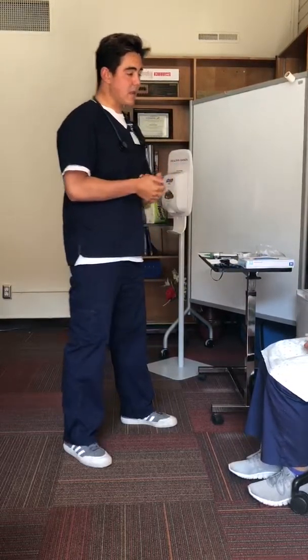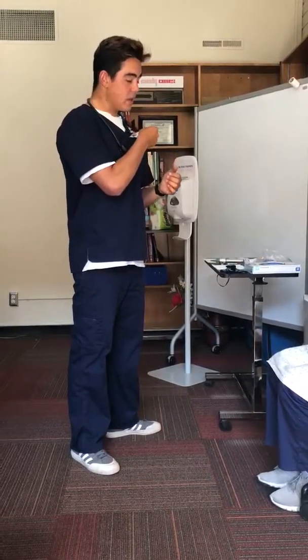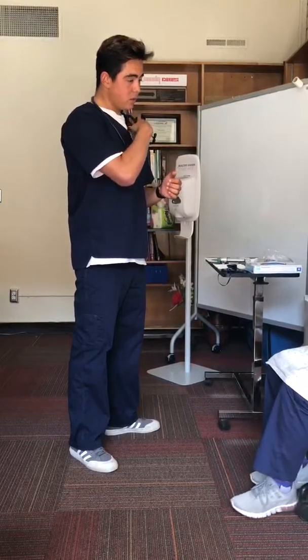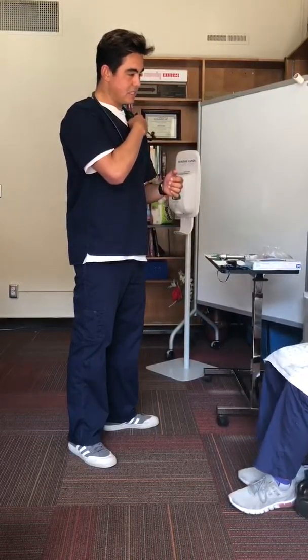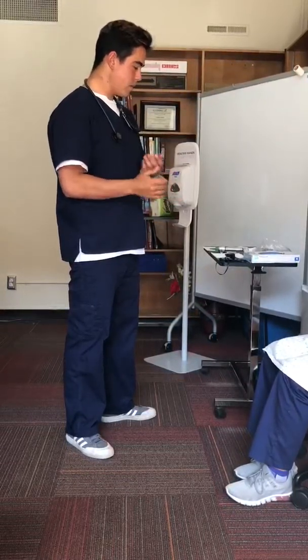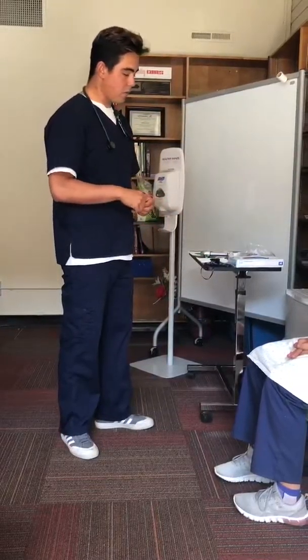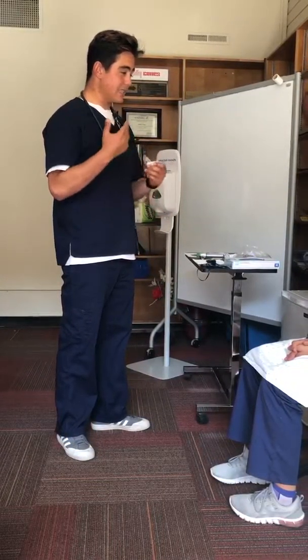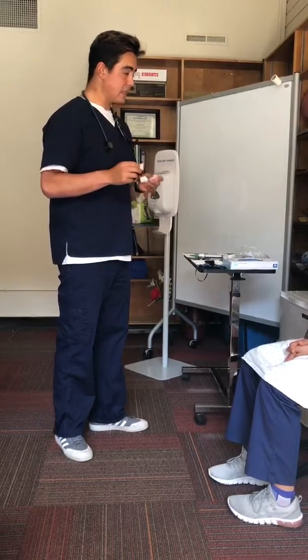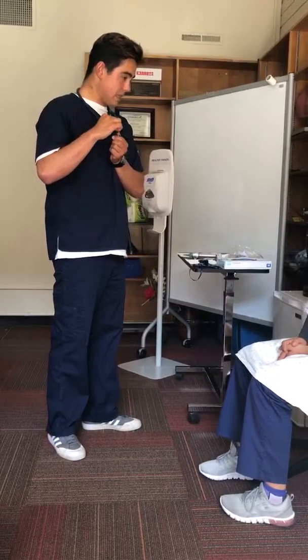So since you came in today with an asthma exacerbation, we're going to go ahead and give you a unit dose of albuterol. Okay, it's going to help open up your lungs a little bit, help you breathe a little bit easier since you're having a little trouble breathing right now. Have you ever had albuterol before? No. Okay. One of the side effects of albuterol, or a couple of them, you can have shakiness, a little bit of dizziness, dry mouth, or increased heart rate. Okay. If at any time during our treatment you notice that, let me know immediately and we'll go ahead and stop, okay?